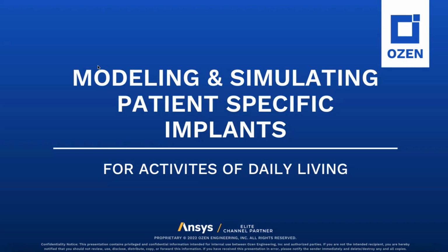Good afternoon, everyone. Welcome to our webinar on modeling and simulating patient-specific implants. This includes designing and simulating these implants for activities of daily living. And what do we mean by that? We'll explain.